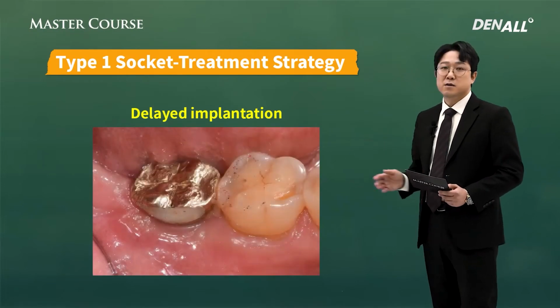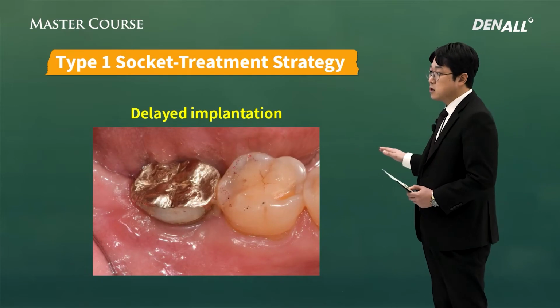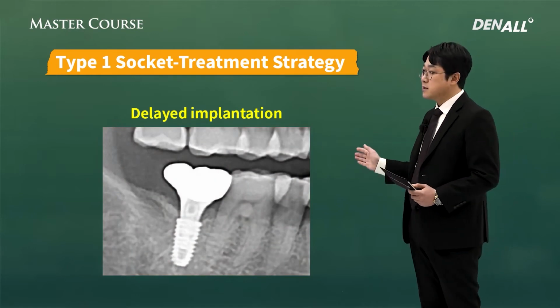This is after treatment. You can see that there's balance between the surgical site and adjacent tissue. And this is after implant treatment.